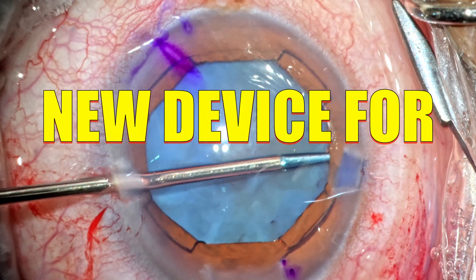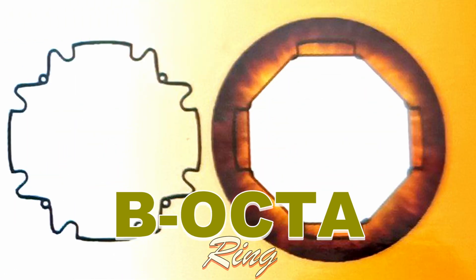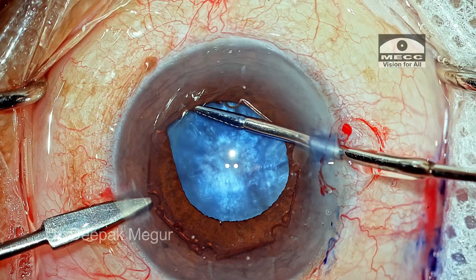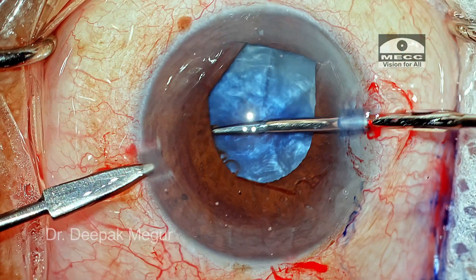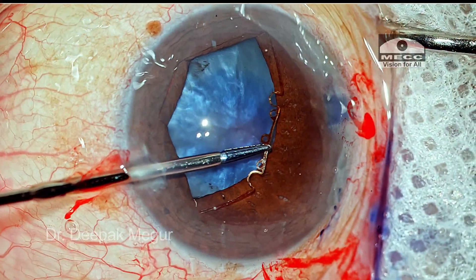We have a new device for small pupils — it is the B-Octa. I am going to share my first experience with it. We have been using the much-loved BX device for the last many years, and BX was a pioneering innovation which made pupil expansion devices accessible and affordable to Indian surgeons.